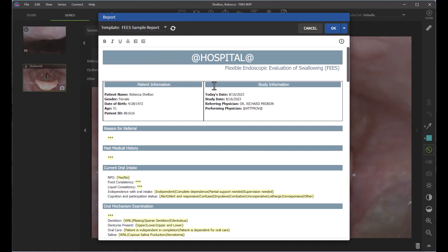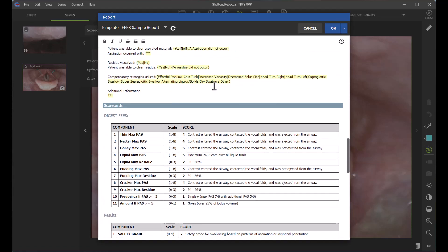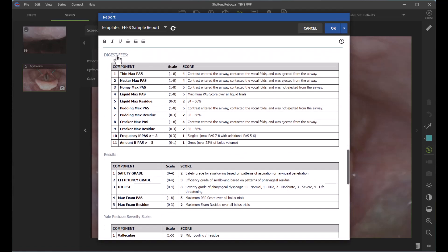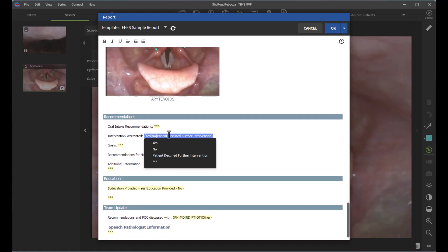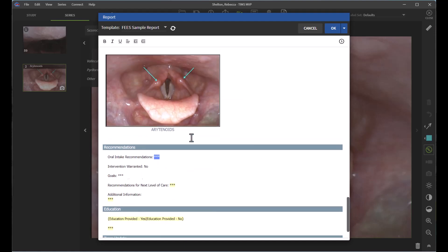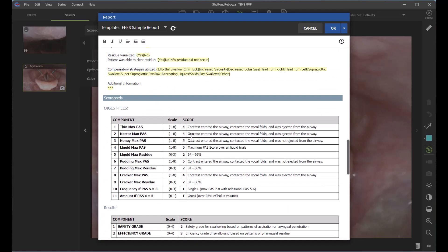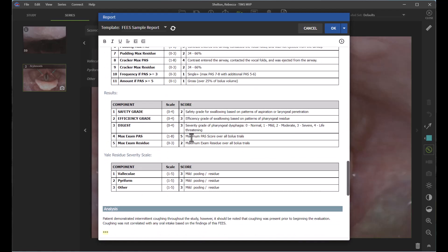You can see this is a template that has already been started. My scorecards have automatically populated — I've got my DigesT FEES and my Yale here. My analysis section also has my notes from the sticky note I just showed you, and the TIMSS software automatically pulled over my snapshot as well. Each of these sections has dropdowns and opportunities to free-text, similar to many EMR systems used in clinical practice.